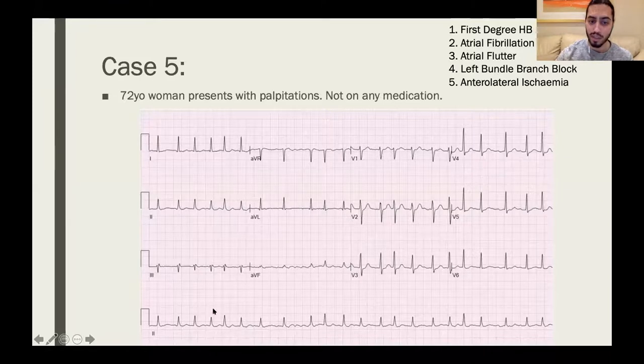Well, if you look between the QRS complexes, you want to see if there's multiple bumps. The T wave has a morphology which is kind of flatter and a bit wider, and a P wave is a bit sharper and smaller of an actual rise. So if you look at this ECG, you can see some T wave here. That's like a flattened broad wave, okay? But you can't actually see any P waves at all.